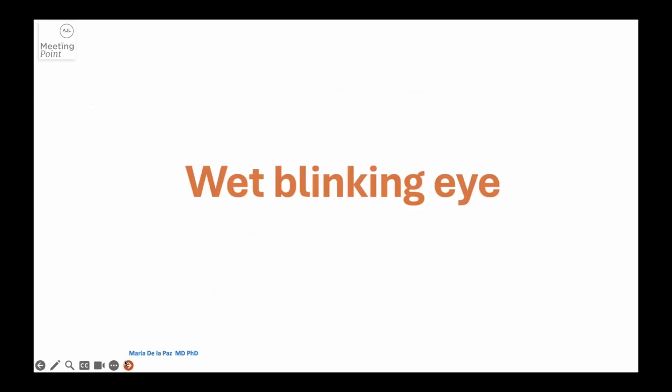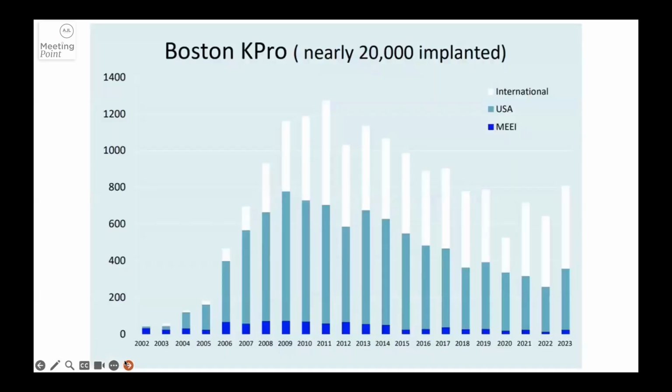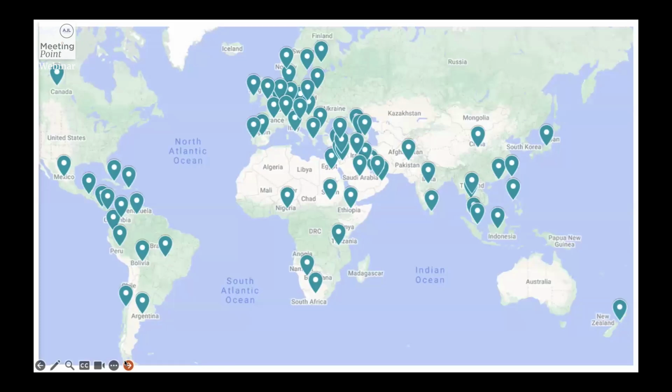So, wet blinking eye. We know that the Boston KPro from Massachusetts is the present winner for all the keratoprosthesis because it is very easy to use, and it has actually been implanted in all parts of the world, in all corners of the world, including the Philippines, where I am from.